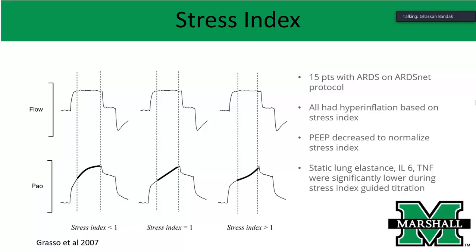If you push a lot of air fast, then you slow down, the buildup of pressure across time might not be purely because of PEEP, okay? Because you gave pressure at variable rates. You want to control everything and leave the only variable to be the effect of the PEEP on the stress index.